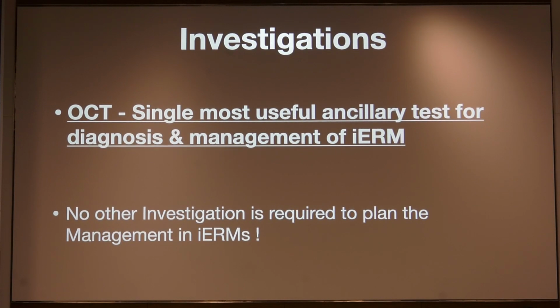Investigations, OCT is the single most useful test to diagnose an idiopathic ERM. Honestly, there is no other investigation that is required to plan management of these ERMs.